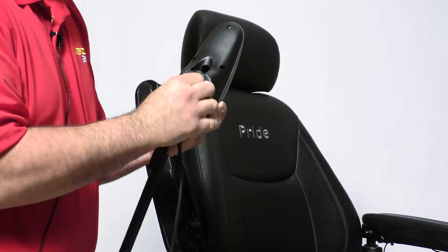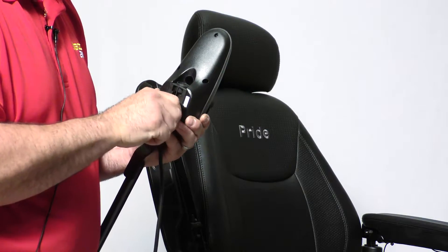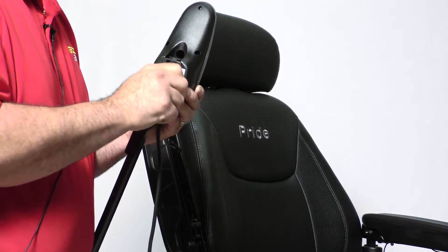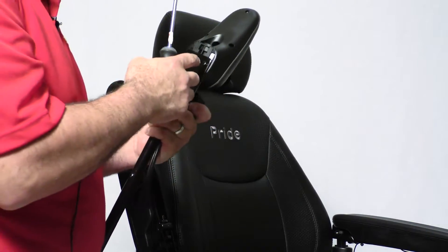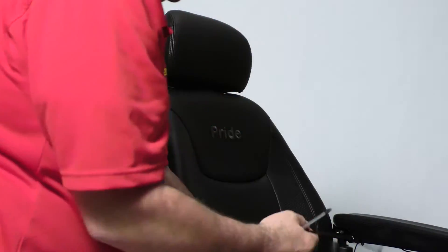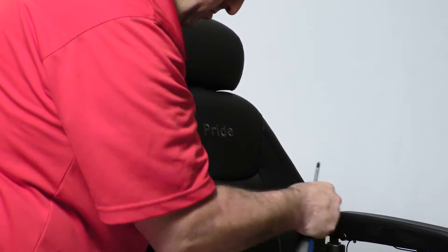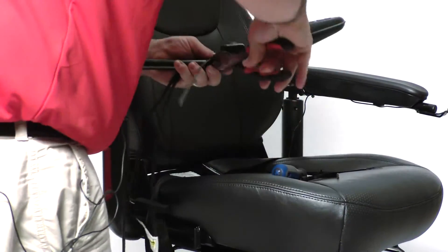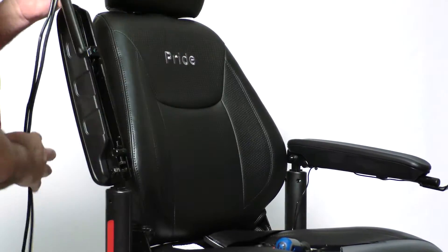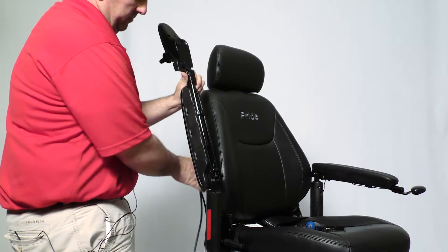Now with your new joystick, place it back on your inline mount. I recommend doing it first so that your light switch holds the harnessing in place. Take a small zip tie, hold them in place, make sure you cut it flush. And now begin your steps in reverse.